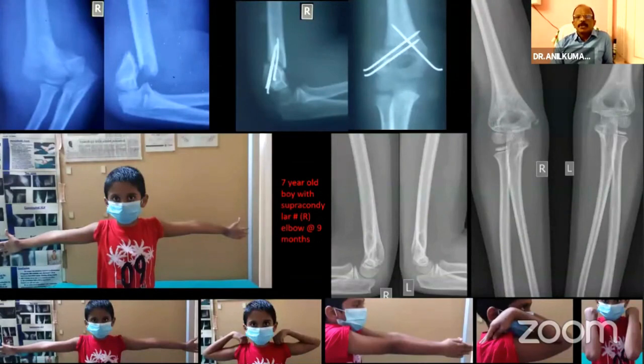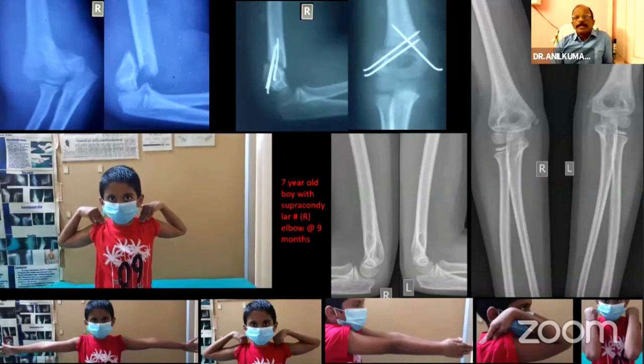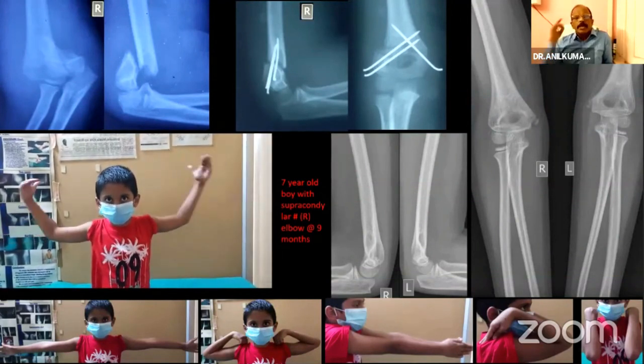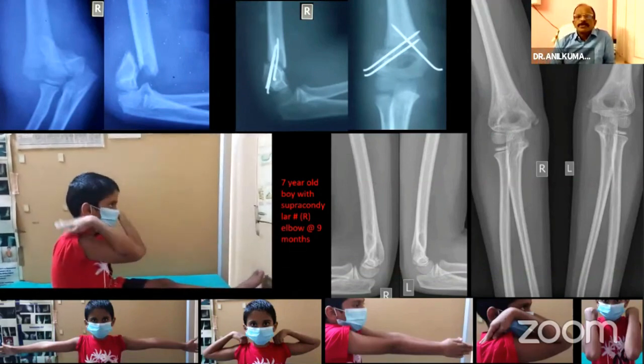This is a 7-year-old boy with a supracondylar fracture, right elbow, the video and X-rays taken after 9 months, and preoperative X-ray and postoperative X-ray and figures are also shown there.